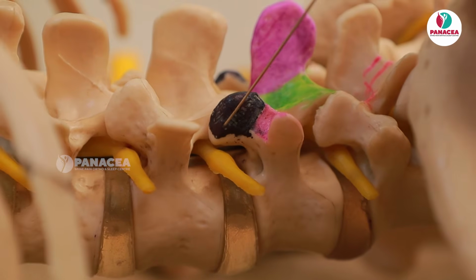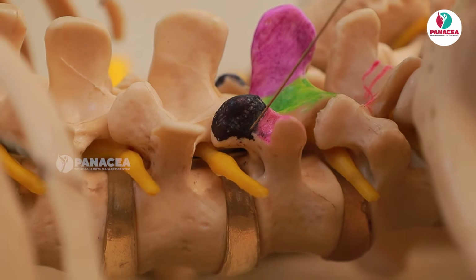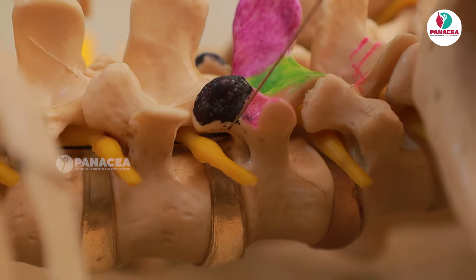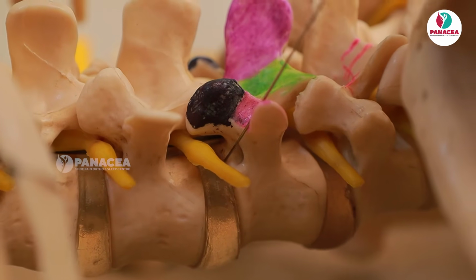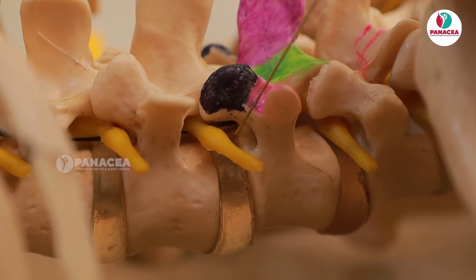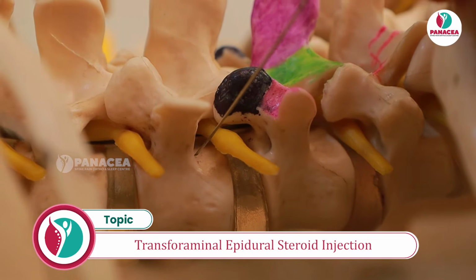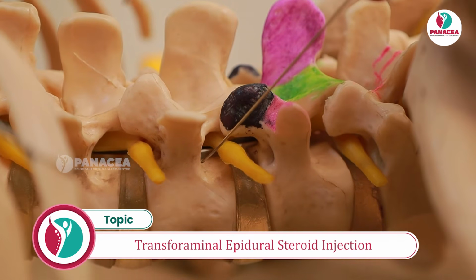So the target area is nothing but the SAP, the superior articular process, lateral border, and you slip along the SAP, the lateral border to the anterior border of the SAP. That's the technique. This is called the infraneural approach because it is below the nerve root. If it is a subpedicular approach, it is called supraneural. You will land somewhere here. This is an area. So the other approach is the supraneural approach or subpedicular approach.